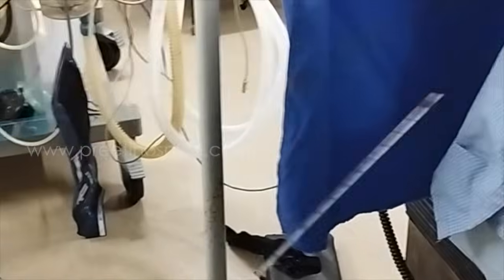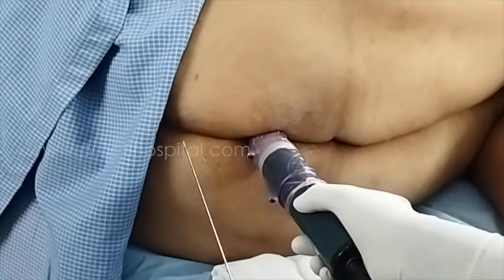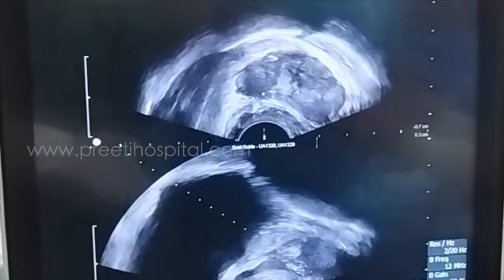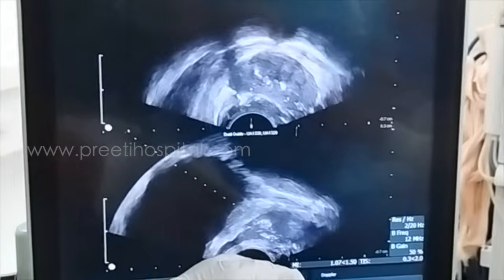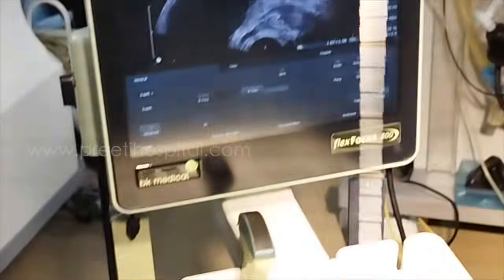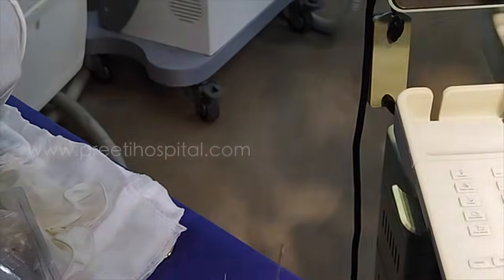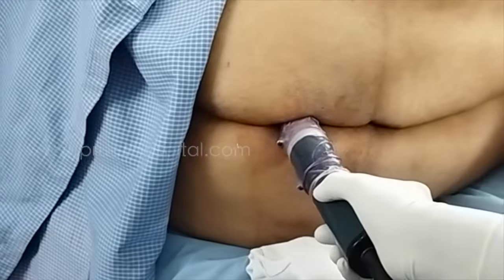Now you take a little bit back so that the gland will come. Are you inserting into the transverse probe only? Yes, sir. Transverse side firing medial. Side firing needle, come back a little bit. Don't insert more. Patient does not have any complaint, very cooperative. This piece has come nicely. This is the 14th piece, the right side base, medial.